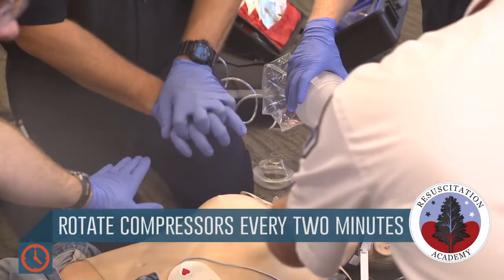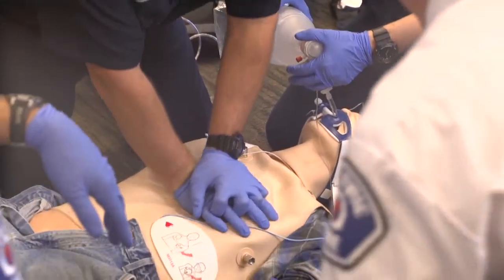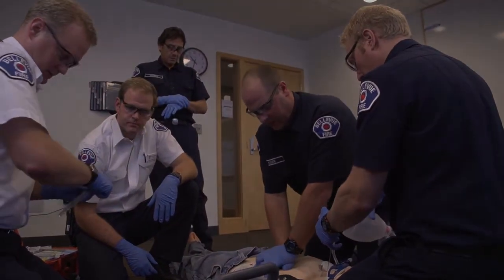Two minutes. Still clear. Shocking. Good. Starting new two minutes of timing. 100 milligrams of lidocaine.